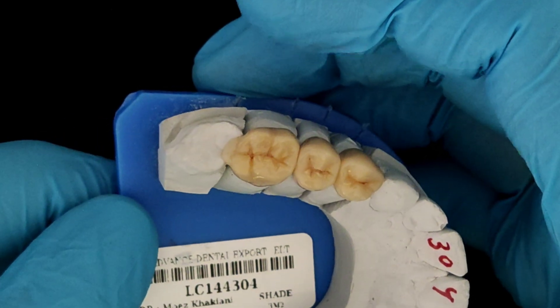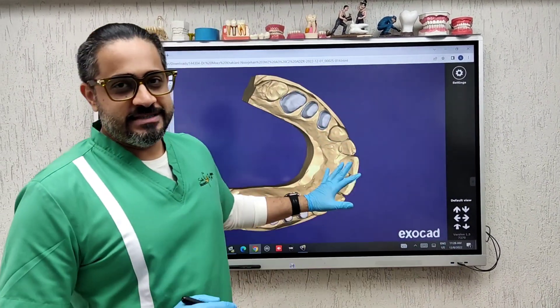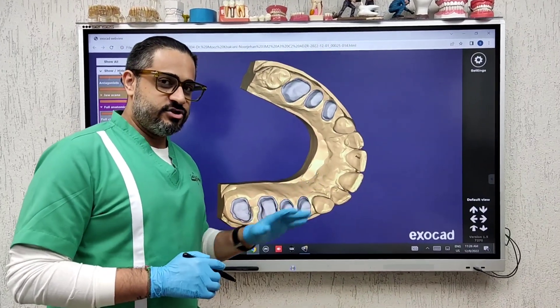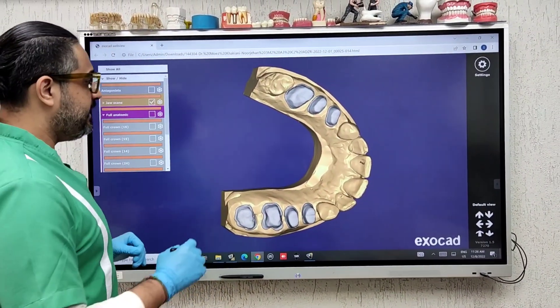Let's see how this looks in an Exocad design. Lab communication is the key here. I want you to see this Exocad that the technician has designed for me — this is by Advanced Dental based in Surat.